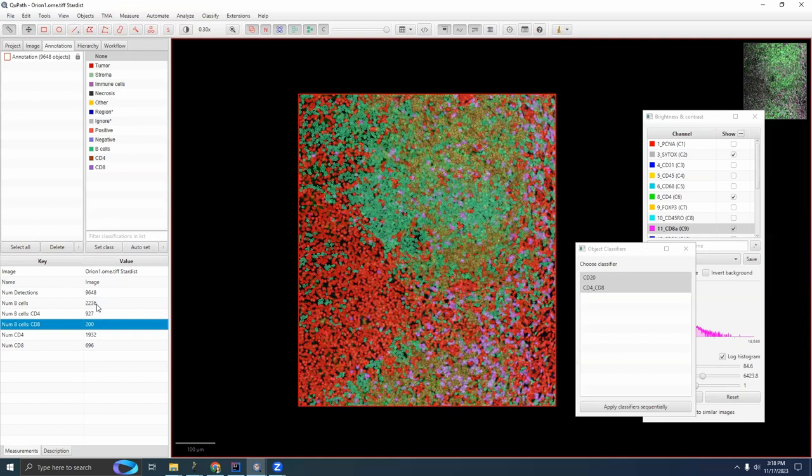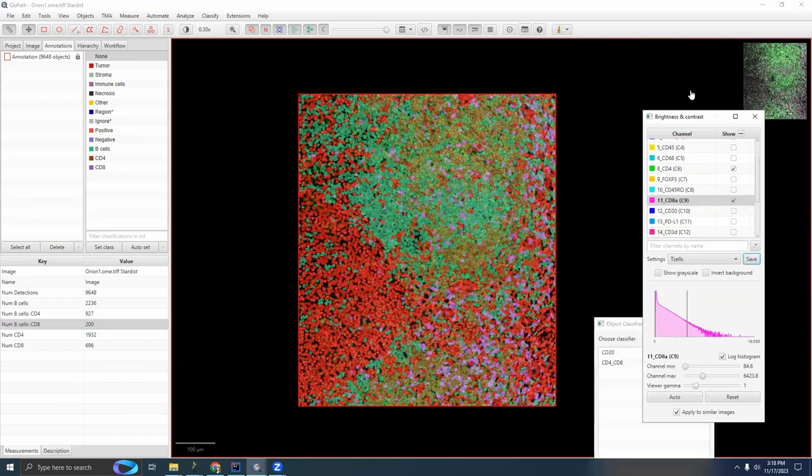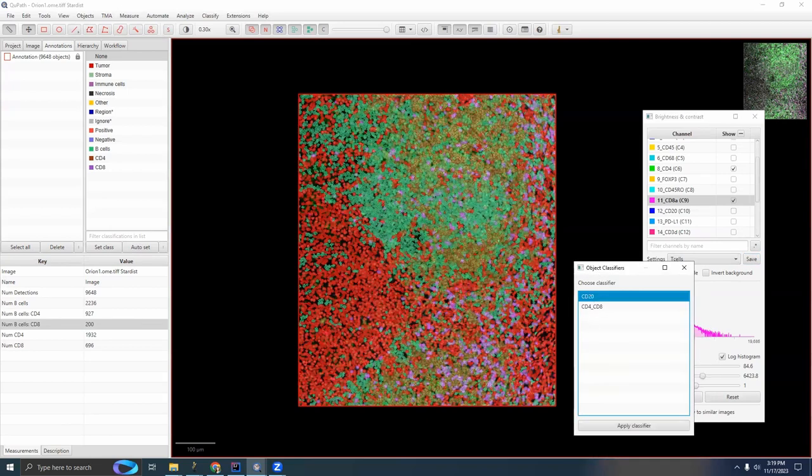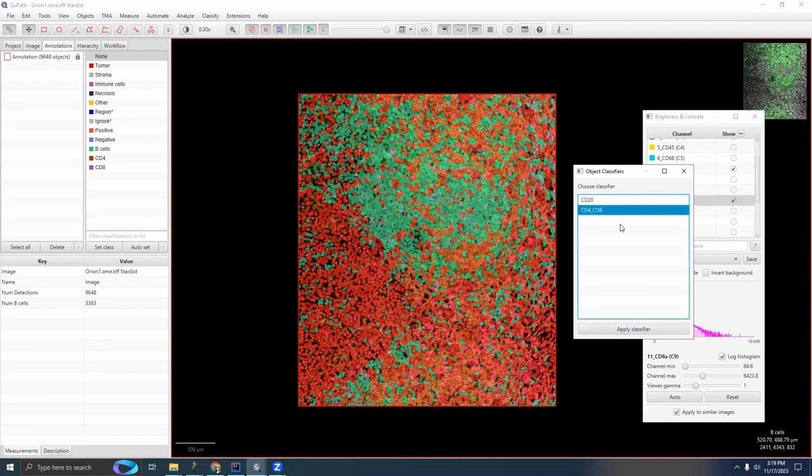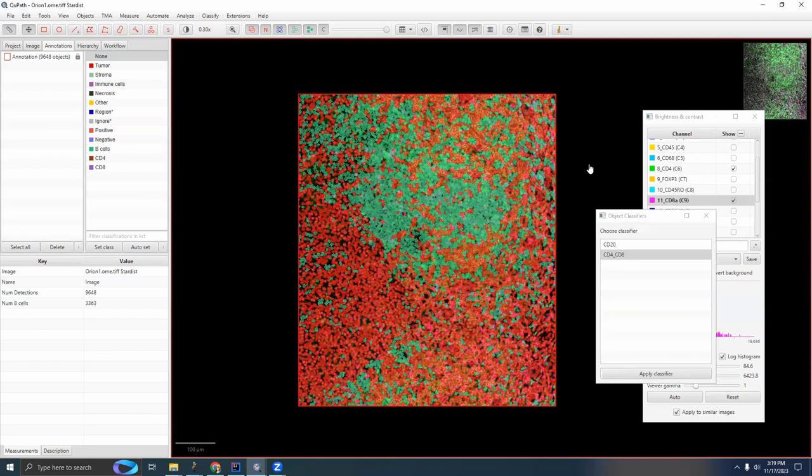But as we get more and more markers, these errors start to accumulate. This image has something like 18 markers, and so the number of impossible classes just grows exponentially with the number of markers you have, to the point where this list can actually become overwhelmed with more impossible classes than the classes you're actually looking for. So it would be really great if we could apply the CD20 classifier and then only select the B cell negative, the non-B cells, and then apply the T cell classifier. But unfortunately, within the user interface, there isn't a way of doing that. We can do either one or the other or both at the same time, but there's no way of doing it hierarchically, like I just described. So let's write a script that can do that.